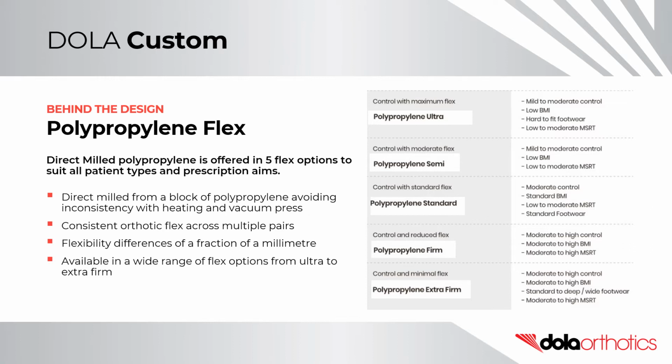A polypropylene orthotic acts by resisting flexion under load of the foot and can be shaped, wedged, or angled to provide orthotic reaction force as required. Therefore, consistency in the product is important. DOLA offers multiple levels of polypropylene flex for prescription, from ultra to extra firm, to suit all patient types and prescription aims.